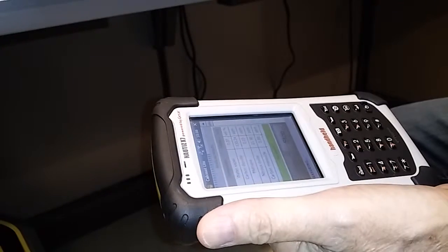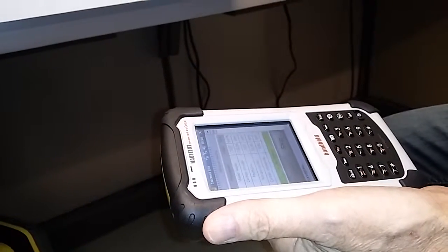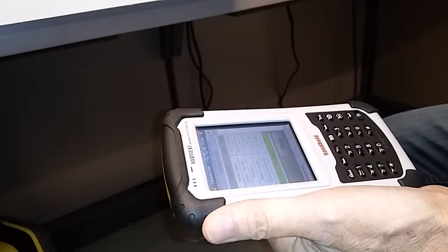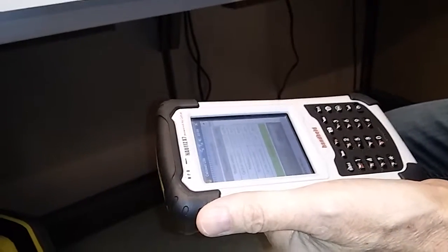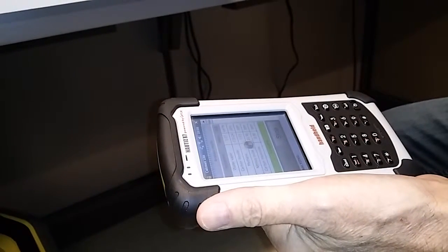Carbon dioxide went up. Wow, we're off on carbon monoxide. There might be interference. I don't know. Nitrous oxide increase. Yeah. Okay, now it's going to be checked again.